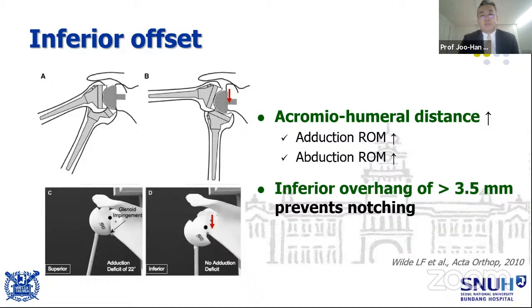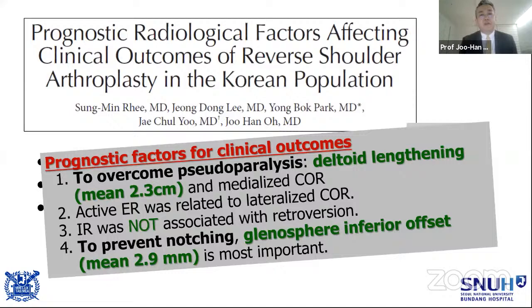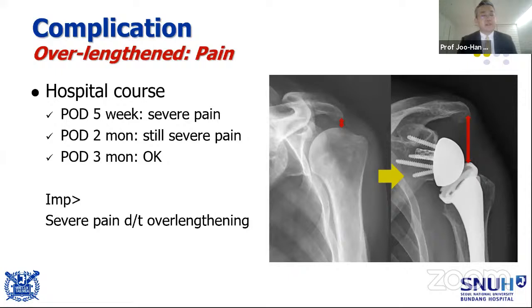According to my two-center study with my friend JC Yu, this inferiorization, that is, inferior offset, is very important to prevent notching. It's probably the most important thing to prevent notching. So I routinely use these eccentric glenospheres to prevent scapular notching. But as you can guess, this kind of inferior offset can produce some pain, even at several millimeters, or cause acromial fractures.